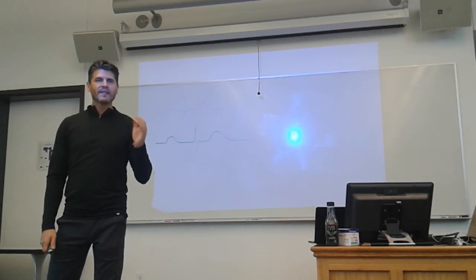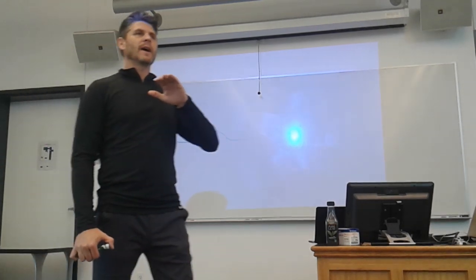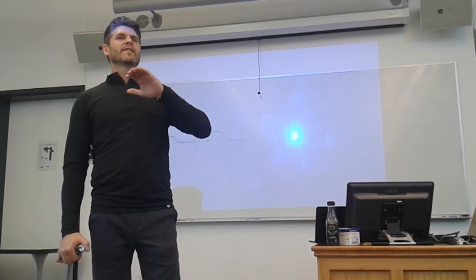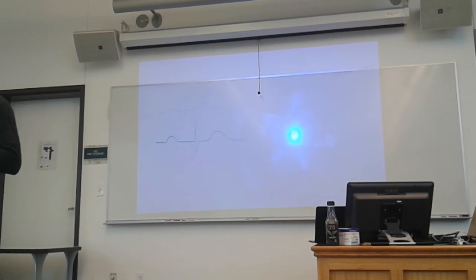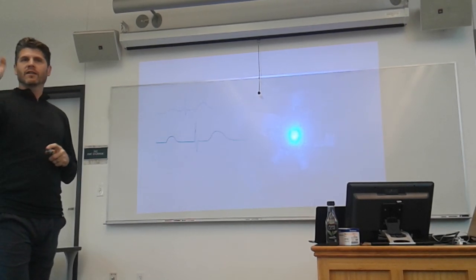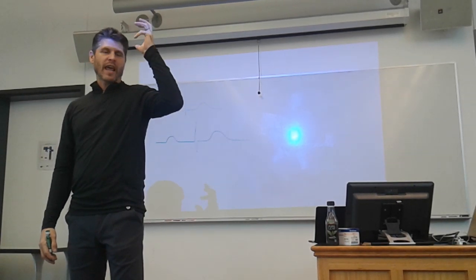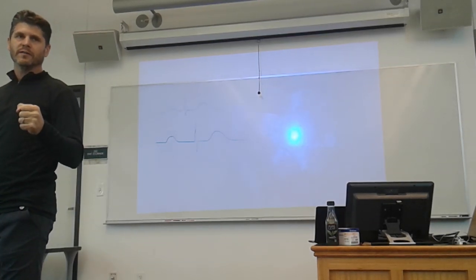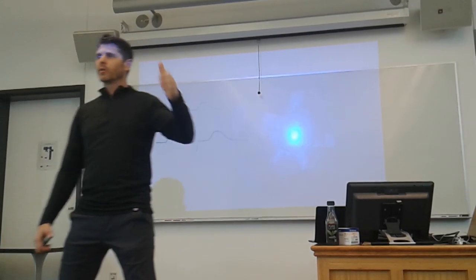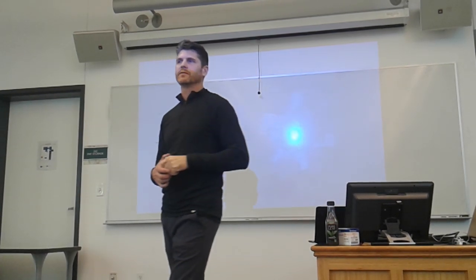The problem is consistent, but it doesn't happen every single time. So what you have is a normal sinus rhythm trucking along, and then every so often you have something that disrupts the AV node entirely. It's completely disrupted. And then everything's back to normal again, and then it's completely disrupted again.